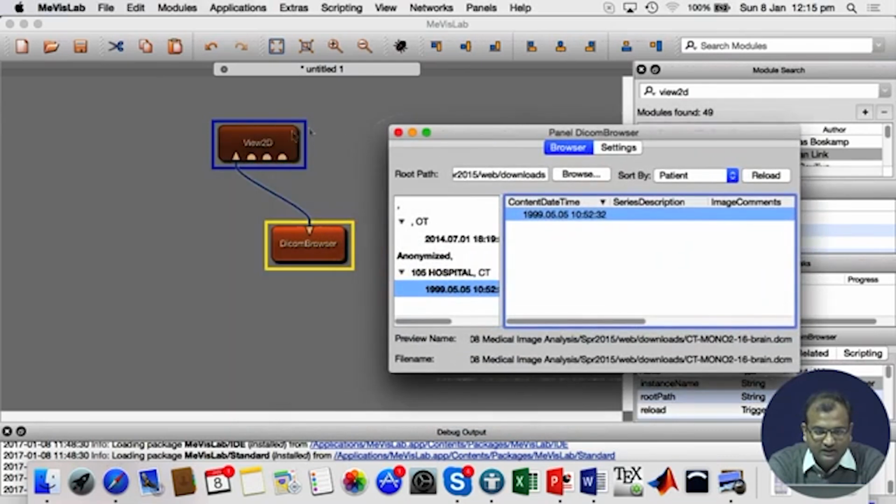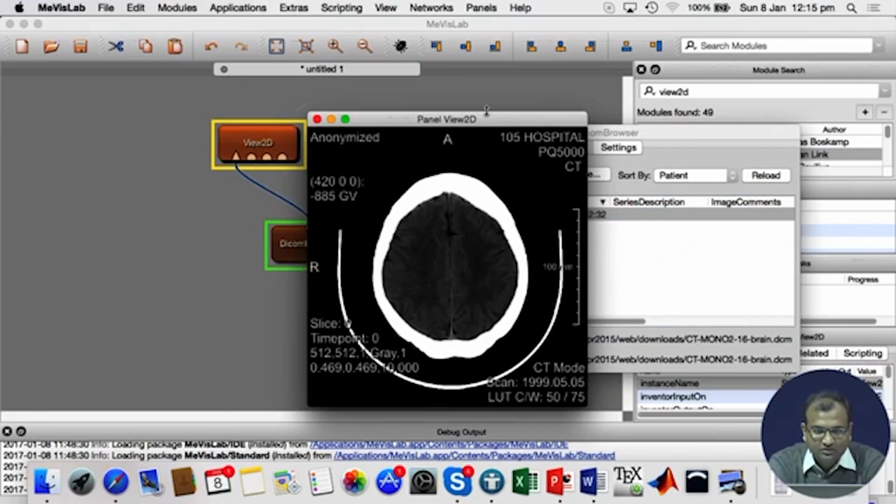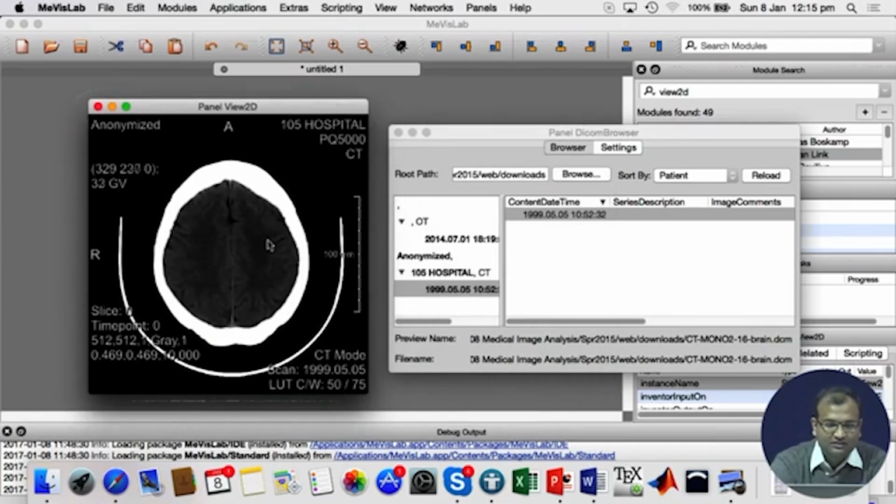and then I need to invoke this viewer over there. So this is what I see when I invoke the viewer. Now this is not a 3D one which I have over here. If you have a 3D, then you will have to invoke a view 3D as well. So I will open up the other one and show you how it looks on a view 3D.